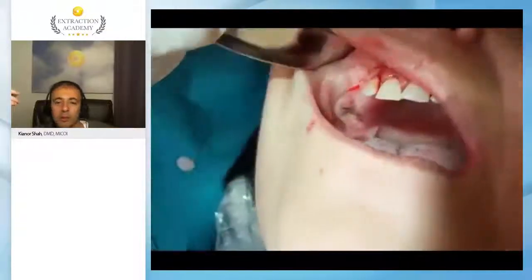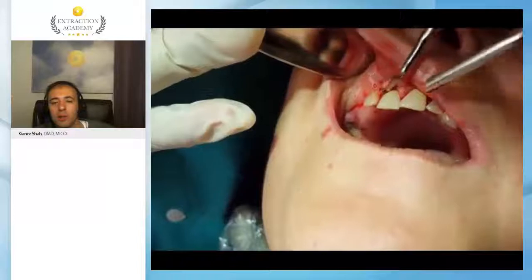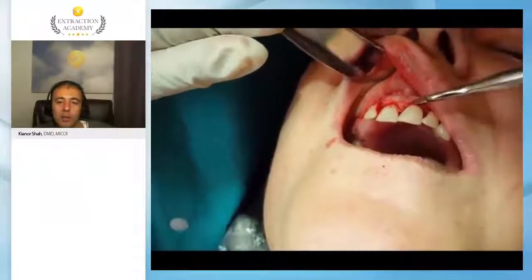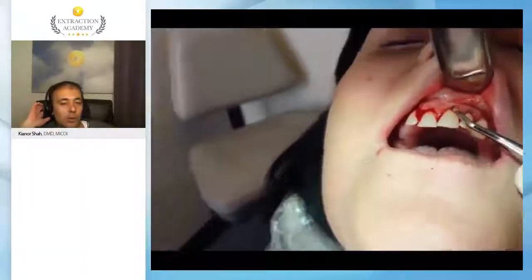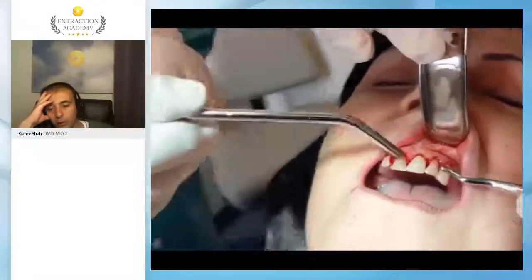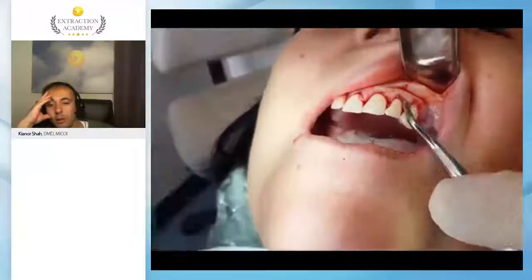You know that the canine is the longest tooth in the mouth. You know that it is extremely hard to get it out sometimes. And you know that if you take the lateral and the centrals out, you're going to have a harder time. You're going to take some buccal bone with you. So the best approach in this case would be to go after the canine naturally first, while you have that support of that lateral, and then remove the rest.